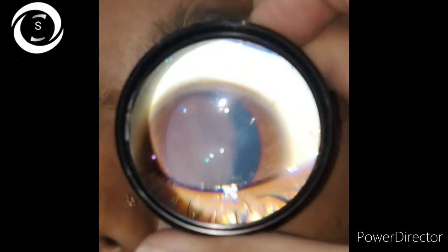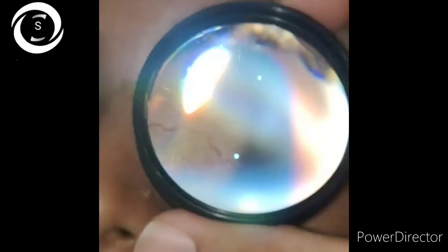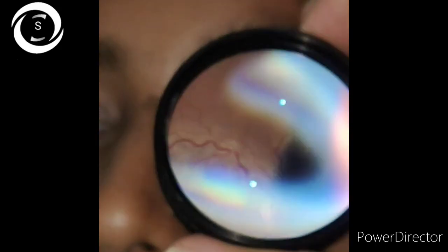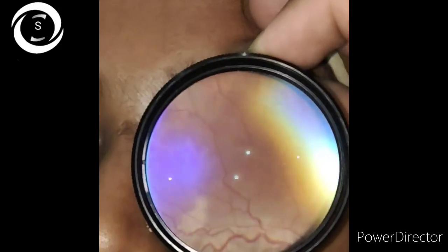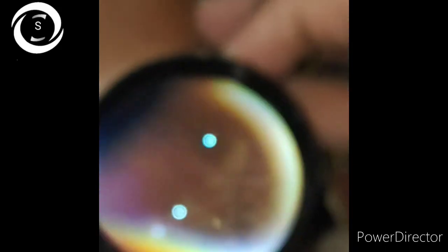Her vision was 6/6 in the right eye and 6/60 partial in the left eye. Pupil of the right eye was reactive and left eye sluggish. IOP was normal in both eyes. When I examined the fundus, I found these lesions centered on the disc and radiating in peripapillary area in a serpentine snake-like pattern.